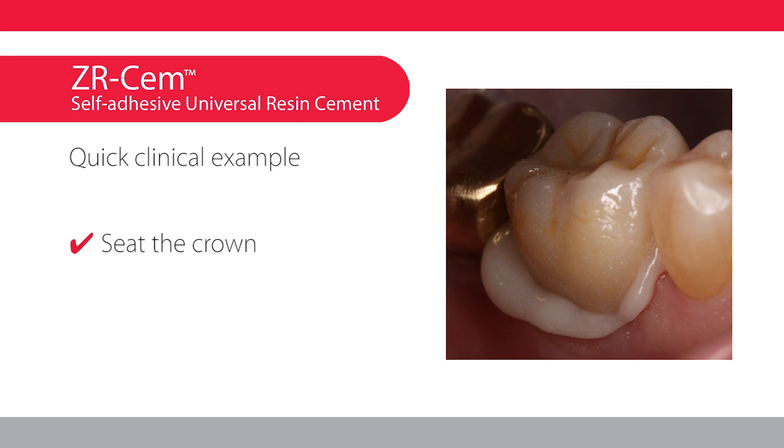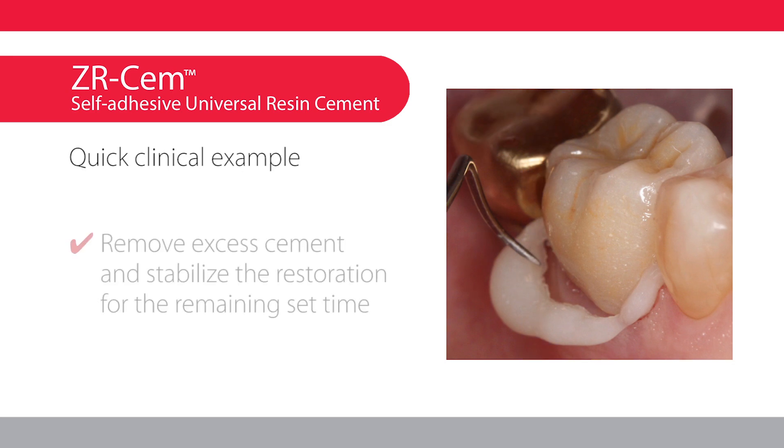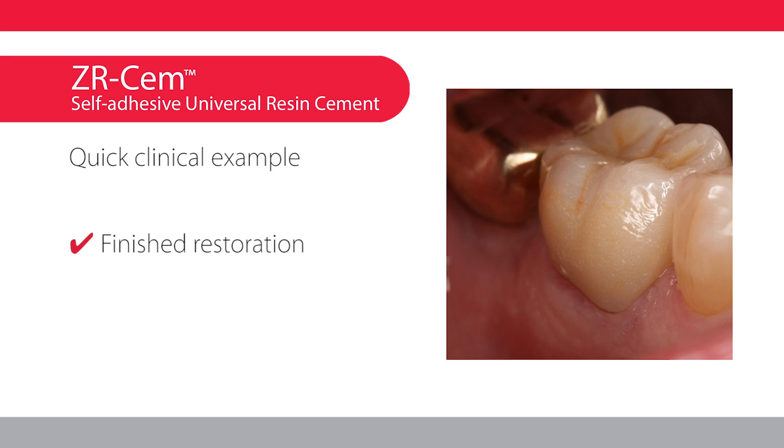Dispense ZRCEM into the crown and seat the crown. Apply a 3-second tack cure. Remove excess cement and stabilize the restoration for the remaining set time. And then you have a finished restoration.